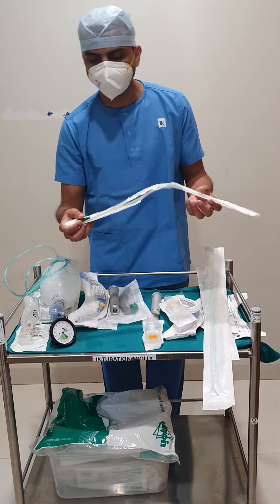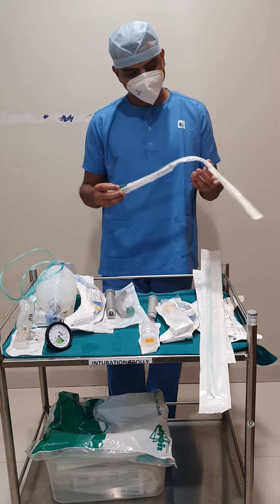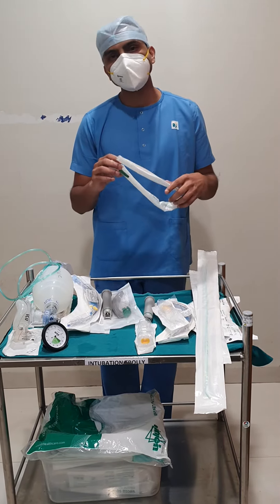Suction catheter — different sizes. For adults, it is size 14 French. This is used to remove secretions from the airway.